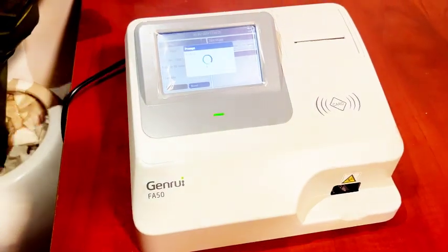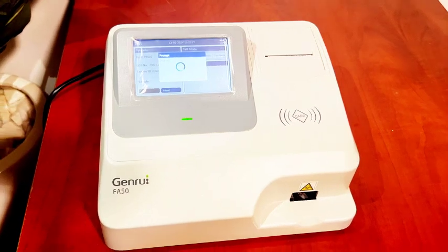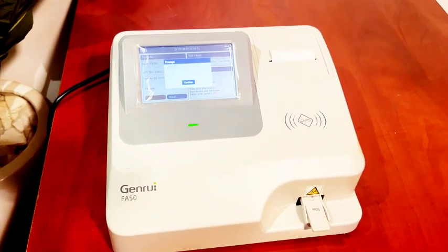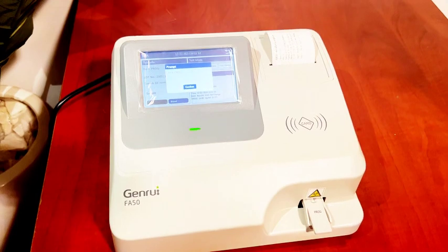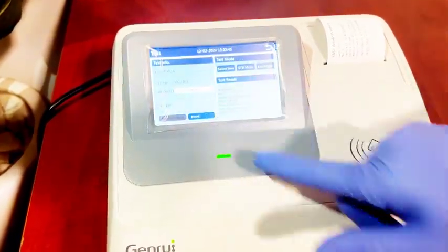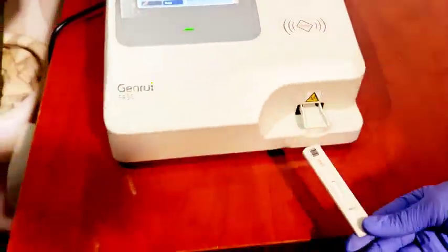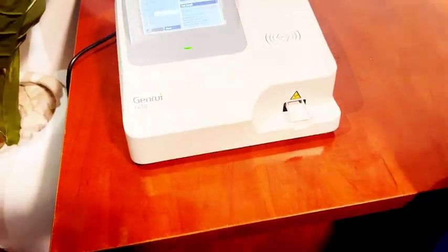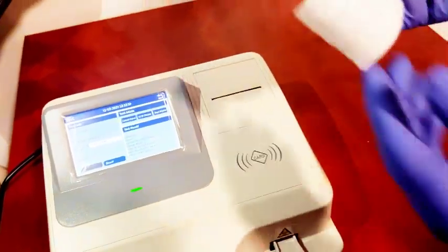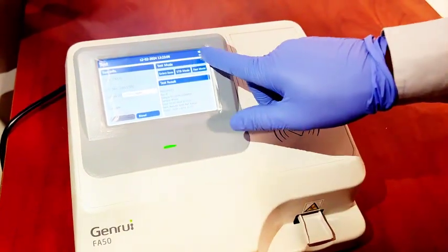Allow the machine to run for 15 minutes. The result is now out — confirm, and you can see the result on the paper and also on the screen. You can now bring out your cassette and discard it. Drop the result out — this is the result — and you can now remove the cassette.